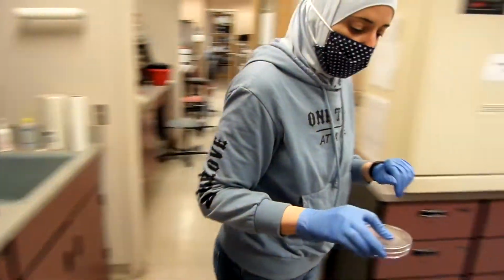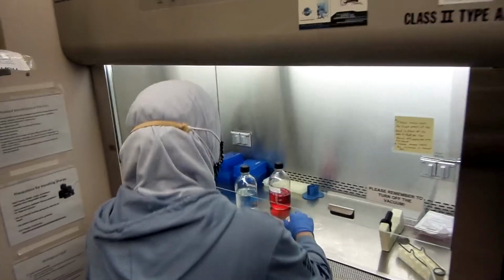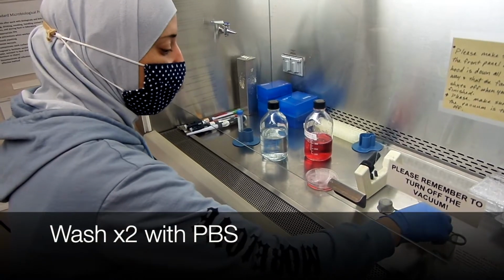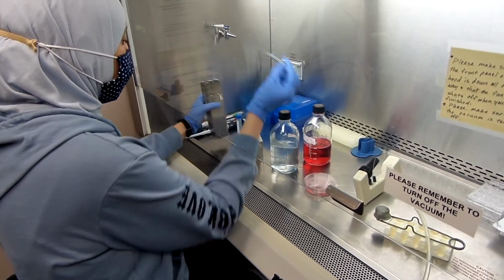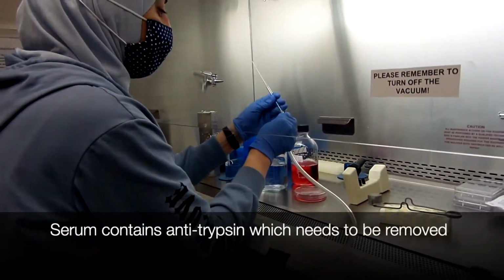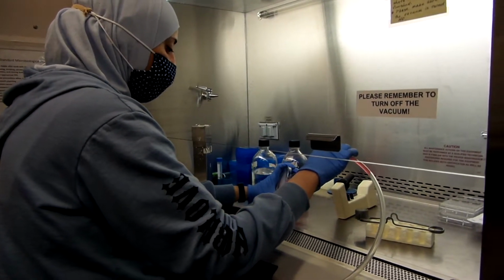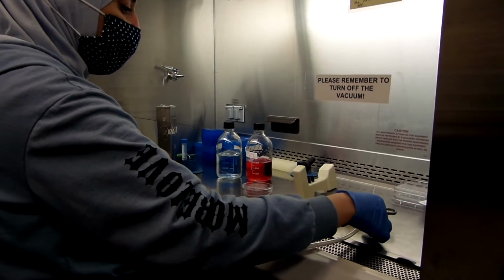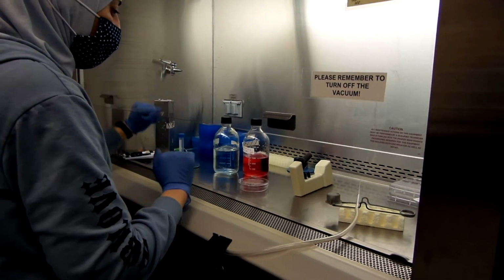Okay, so we'll start passaging or splitting cells. What we will do is aspirate the media and wash the dishes twice with PBS, phosphate buffered saline, the sterile buffer. And the idea to wash is to get rid of the serum because cells have been grown in serum. So we'll aspirate. And again, everything is sterile. Make sure that the tip of the Pasteur pipette does not touch anything. It's sterile. It has been autoclaved.